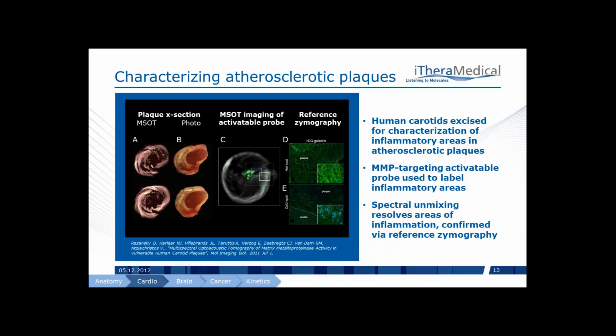So we know that MSOT can accurately show us the distribution of a molecular probe within a carotid artery, and this was, for us, a proof of principle that moving forward with a miniaturization of our technology with respect to catheters could really make sense in a clinical setting.